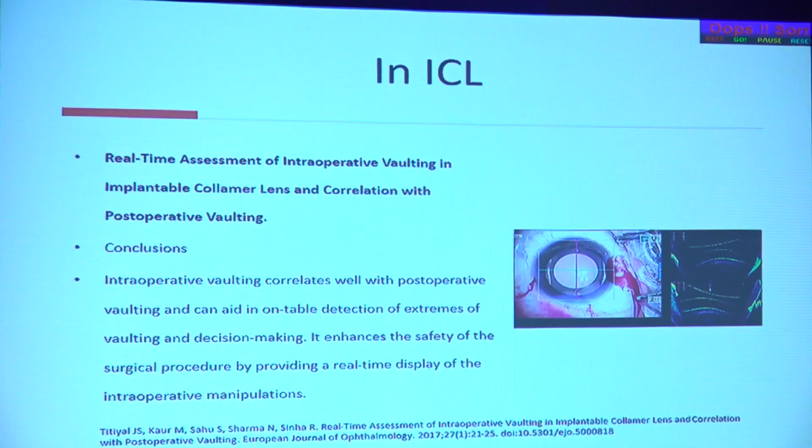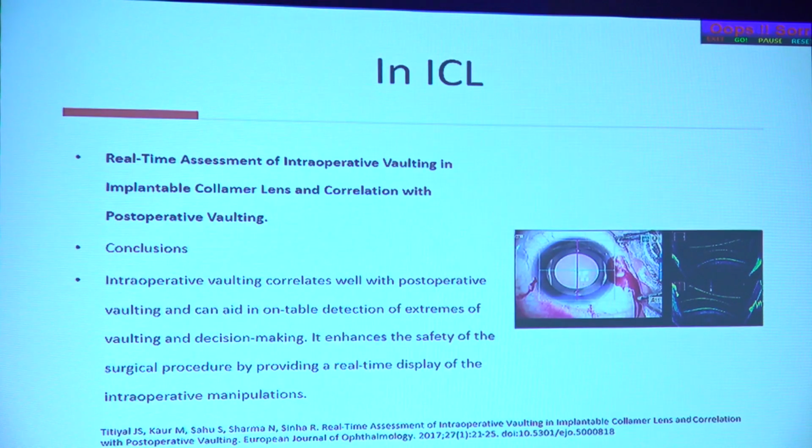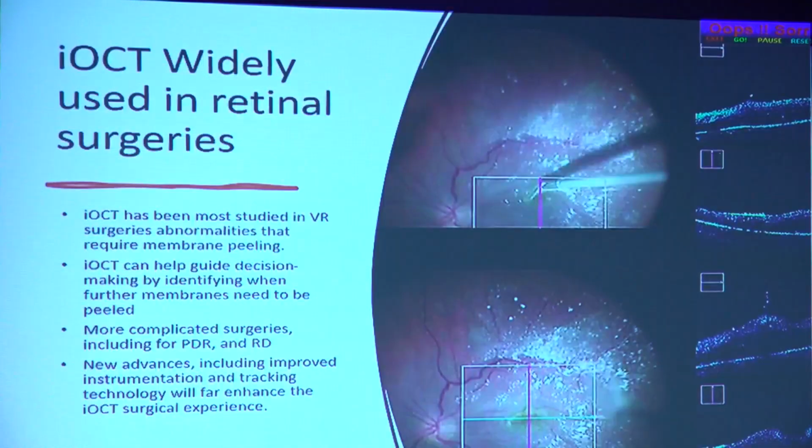The other thing I want to talk about is intraoperative OCT. Unfortunately, I personally do not have experience with intraop OCT, but if you do have this technology, this is where it can help you. In case you're implanting an ICL, you can have real-time imaging of what is happening. You can even measure the vault intraoperatively.